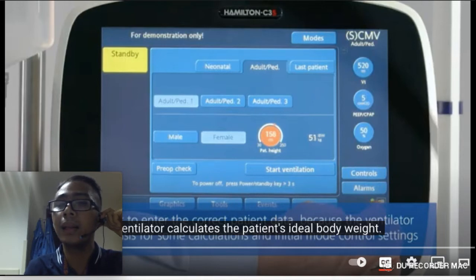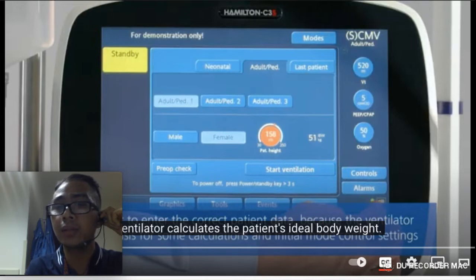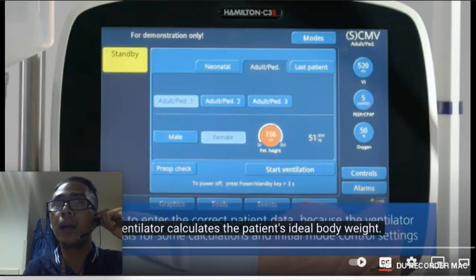Academically, the computation is based on these factors: for a normal patient, the tidal volume in ml is based on 8 to 10 per kilogram. For ARDS, 5 to 6 is conservative. If the patient has COPD, or chronic obstructive pulmonary disease, it is a higher tidal volume. The fixed factor used to compute the tidal volume is the decision of the respiratory therapist based on the patient's condition.